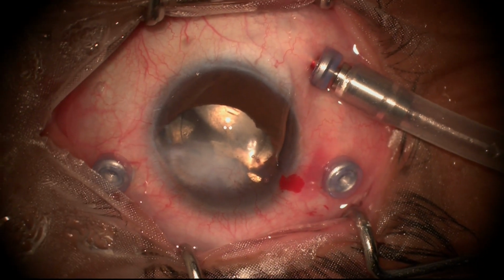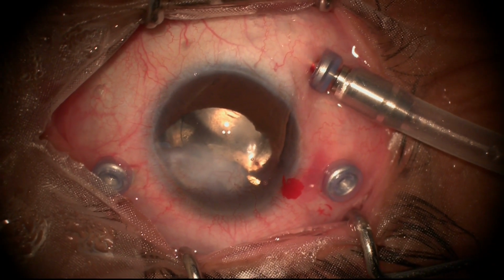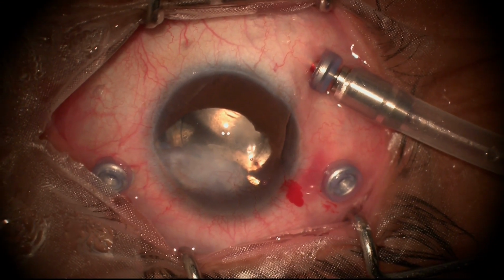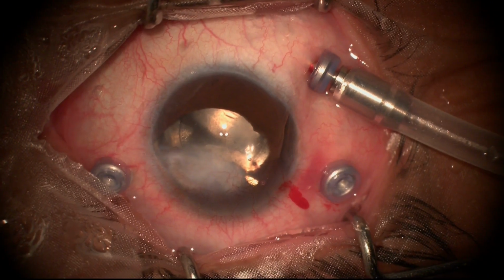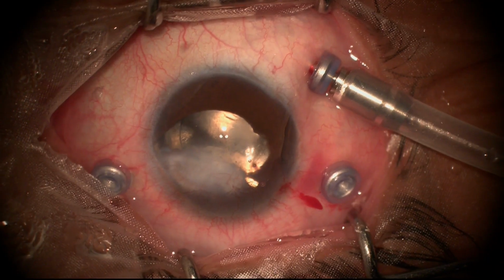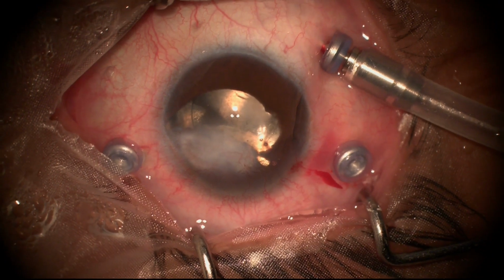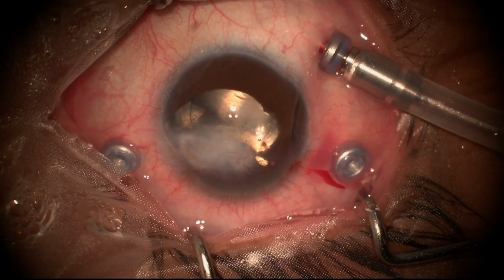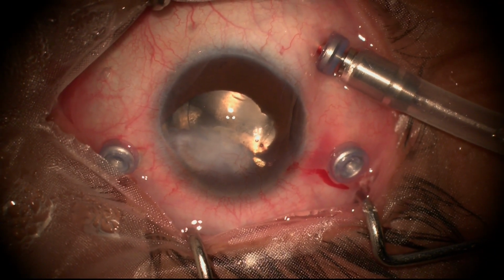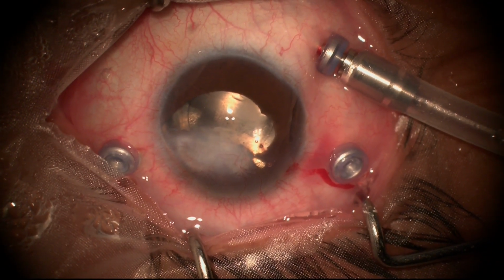Now washing means that we disturb the anterior chamber again and we put in some fluid which will drip down to the posterior segment. So everything has a repercussion here. It's a very, very delicate balance. You don't want to touch it. Have you seen something like Britain's Got Talent, where a person keeps balancing sticks on one stick, and then finally places a feather? When he removes the feather, everything falls. Same goes here: whatever is going on, that is enough.